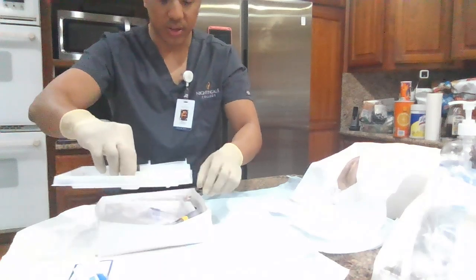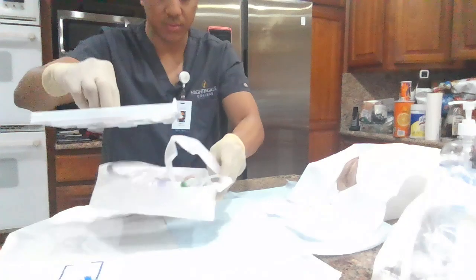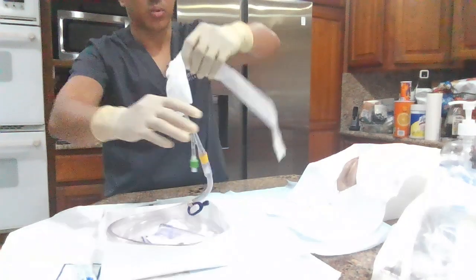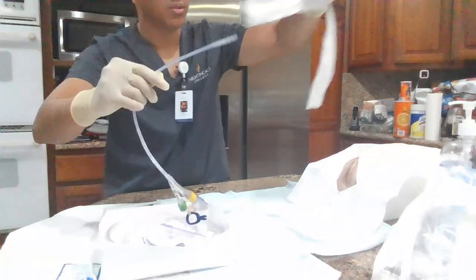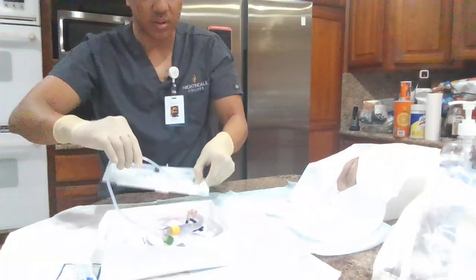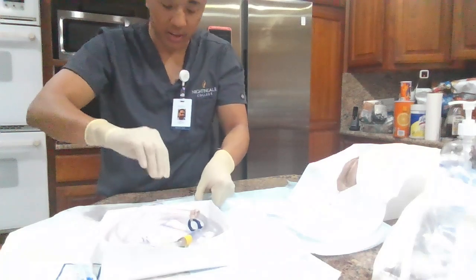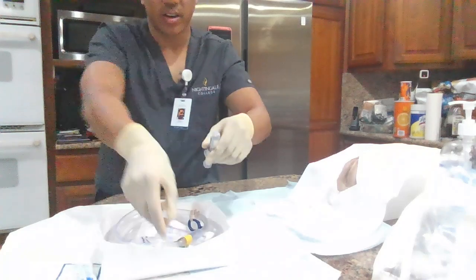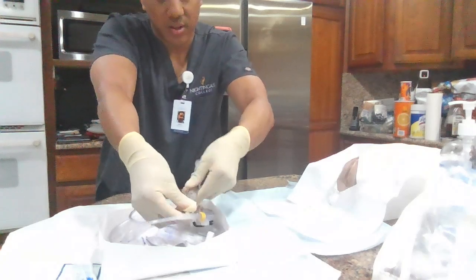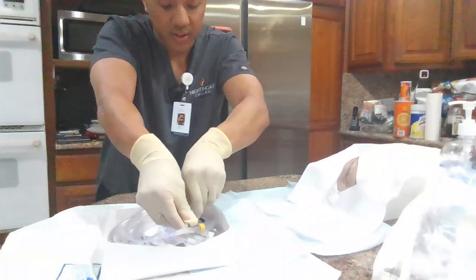I'm going to take my Foley catheter tip, take the wrapper out, and lubricate the tip like this. And then I'm going to take my syringe and attach it to the Foley. Make sure it's nice and tight.